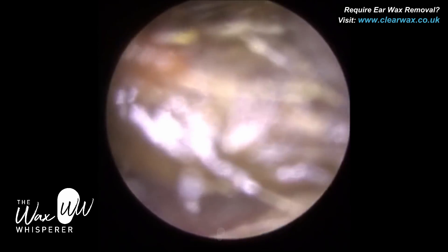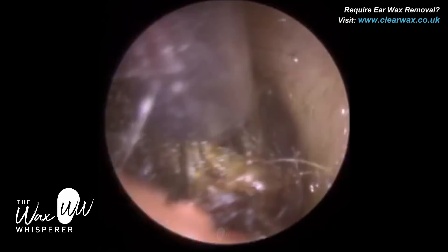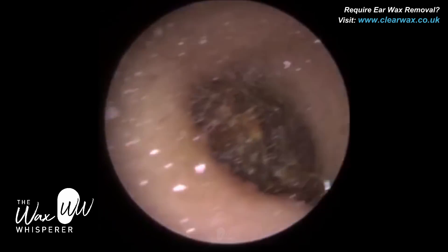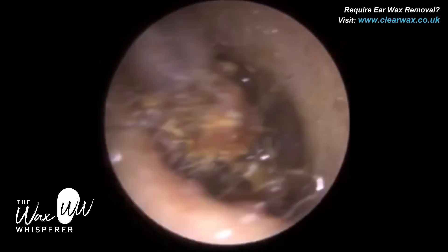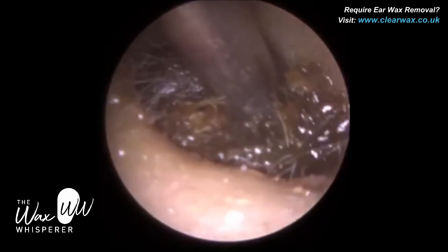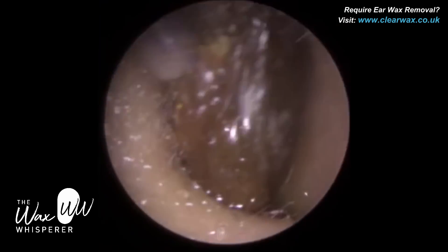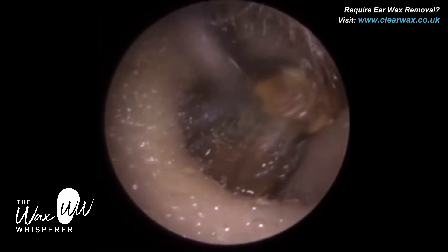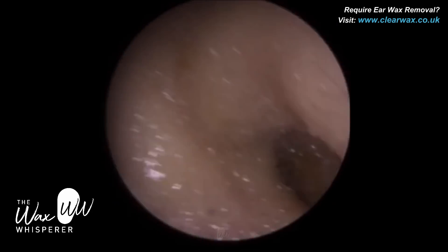I'm just rotating this plug of wax — it's just loosened and I'm moving it out now. It's been about five years since the patient had her wax removed; regular removal is required. Where we used to work, there was a nurse who would come once a week to remove wax and my colleague would just nip in and get it done. But they've since moved on and are working elsewhere. Now just teasing this out — and again we're out of the ear, this is visible externally. There we are — you can see it's quite a dark tail.